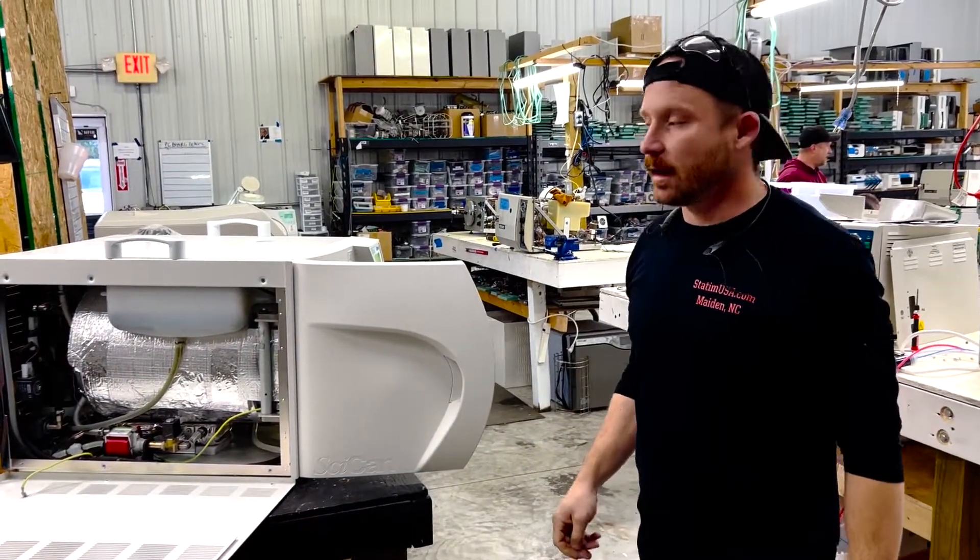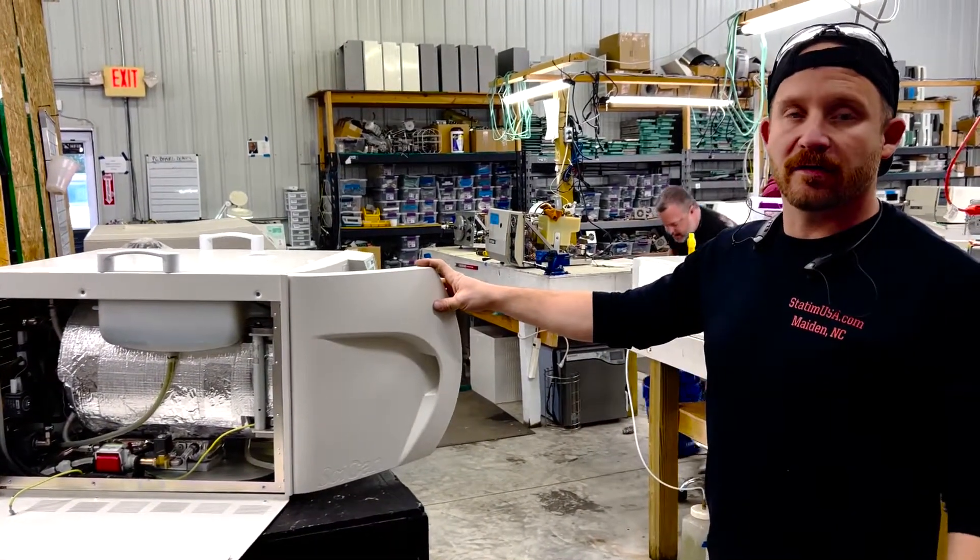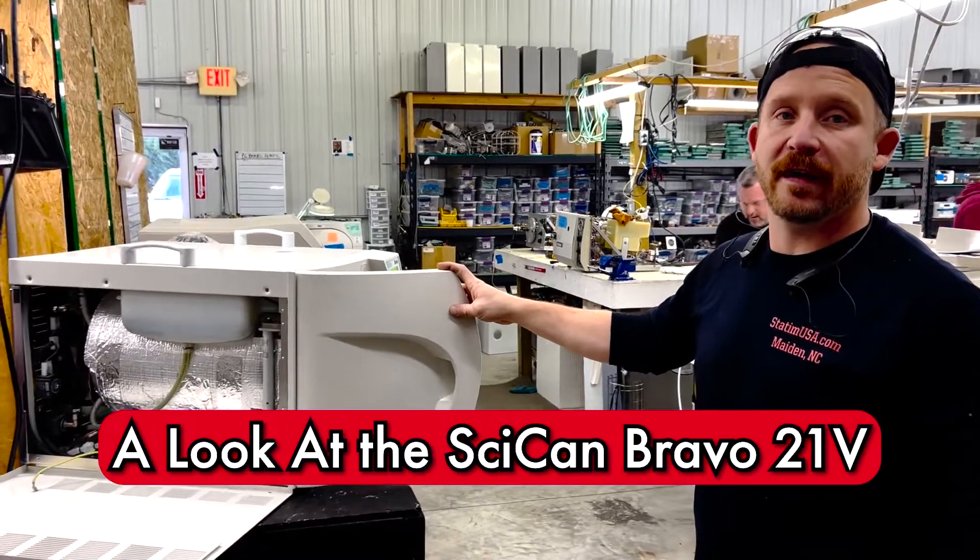Hey there, Andrew here with Sterilizer AutoClave Solutions. We're going to talk about a Bravo 21V right now.